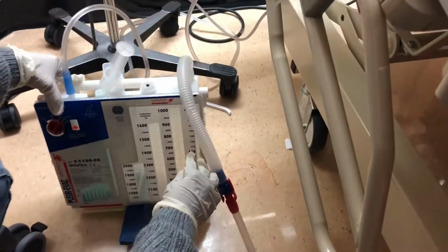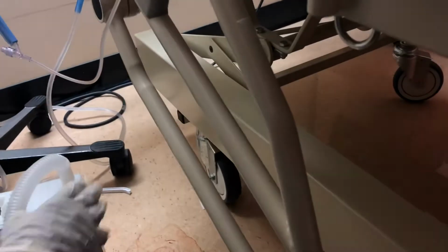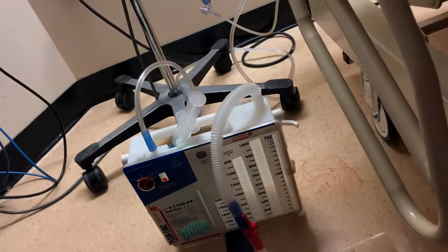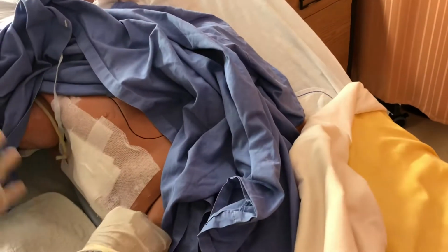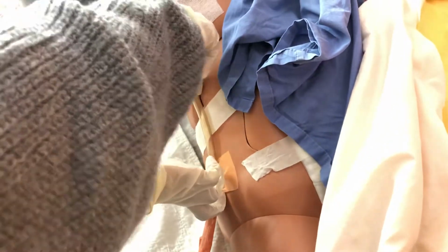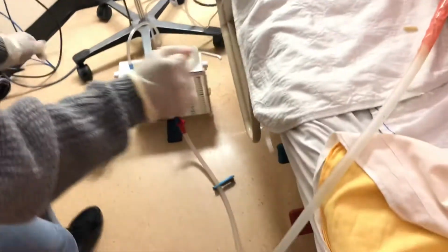And I'm going to note the color, the amount, and I'm going to mark it at the start of my shift. Ensure that this is lower than the patient. I'm going to check the air leak meter. If it's bubbling, that means there's air leak, but it's not bubbling. So if it's bubbling, I would take the clamp and I'll clamp close to the patient. If there is no bubbling, I know that it's here, but if there is bubbling, I'm going to clamp here, and then if it stops, I know that the air leak is within this, and if it does not, then I'll continue like that to figure out where the air leak is coming from.